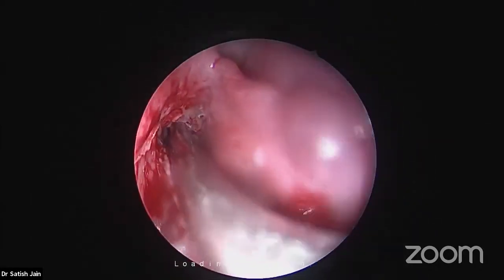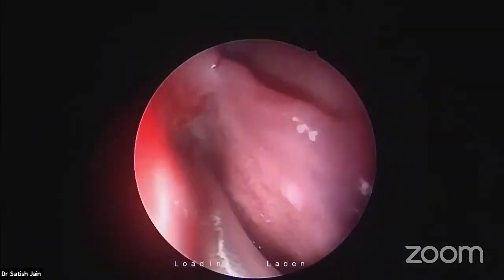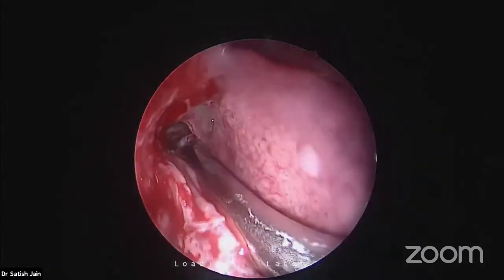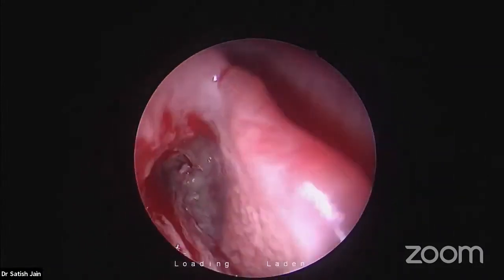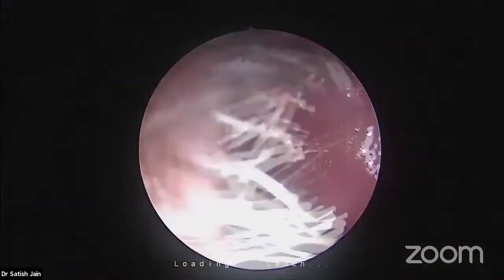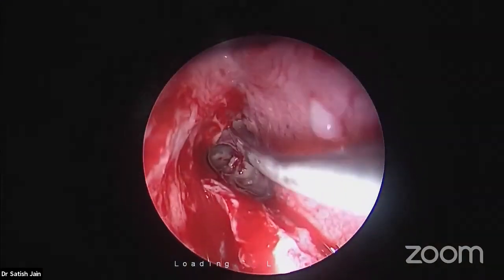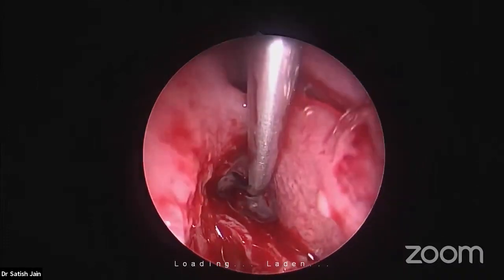See, I told you once you work far anteriorly here, you don't have to look for the anterior ethmoidal artery at all. See my beak, where the beak is ending. See where the beak is ending. What is there? Frontal. This is the beak. Can you see? Beak, and the beak ending is frontal sinus.